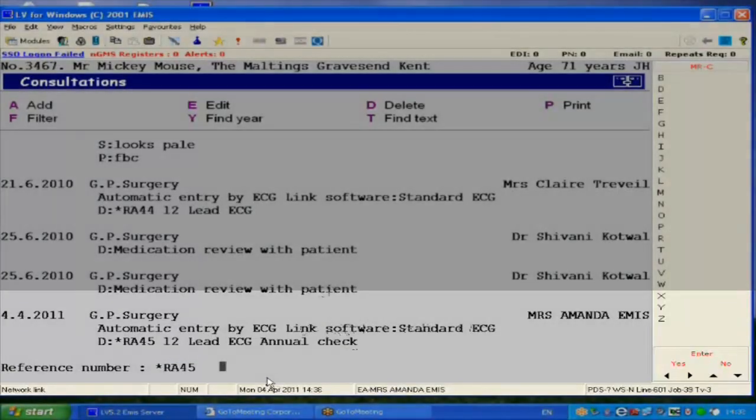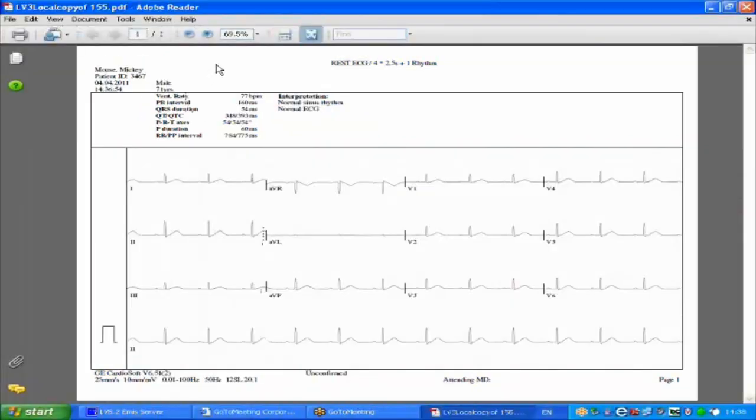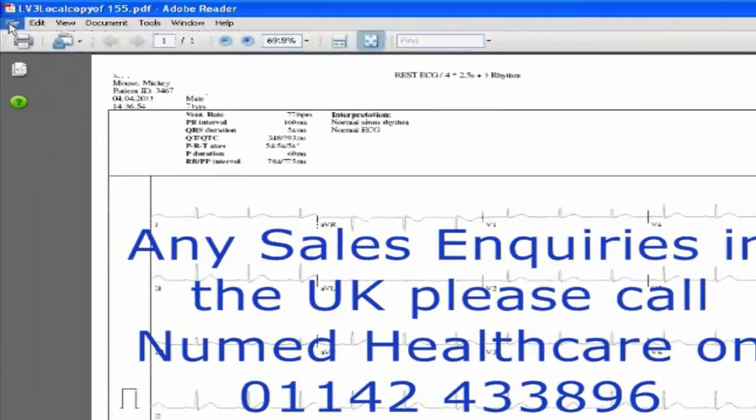In this example, star reference 45. The ECG will now open in the PDF viewer, either as a black and white ECG or colour. These particular settings are configured within the CardioSoft ECG programme. When viewing the ECG, you can print to your local printer.